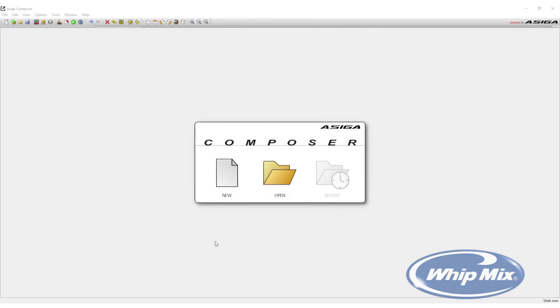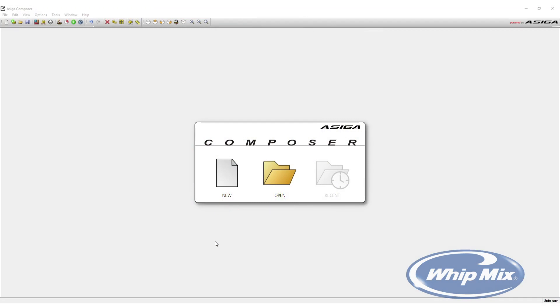Open up the Asiga Composer software on the computer. If this is the first print of this denture, select New. If working off an older design, select Open. This demonstration has the teeth and bases separated into different print designs. The first print will be the bases. Select New to start the new job.